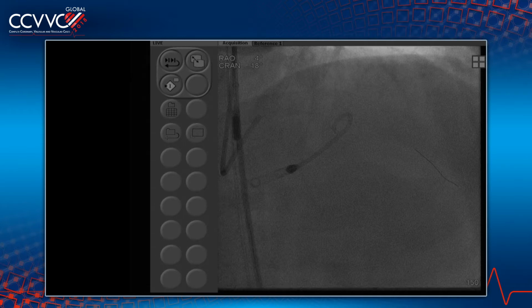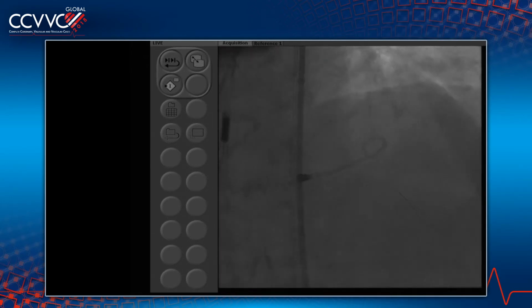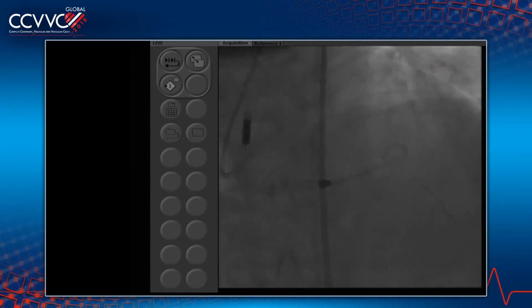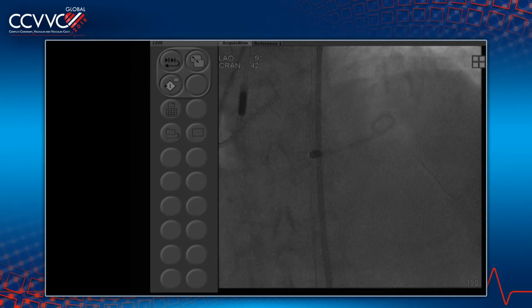I have to see it again. I mean, give me a working view. Show one more time. Can you show him a working view of the LAD diag, left main? Yeah. Okay, this is the working view for us, right? Can you show us the angio? Yeah, we need contrast in there. Contrast would help.